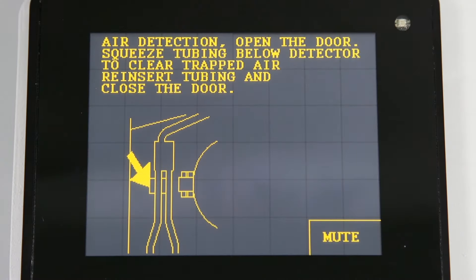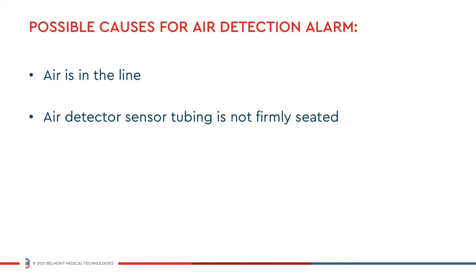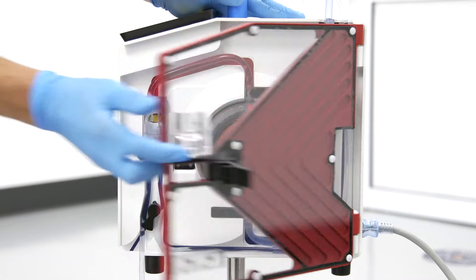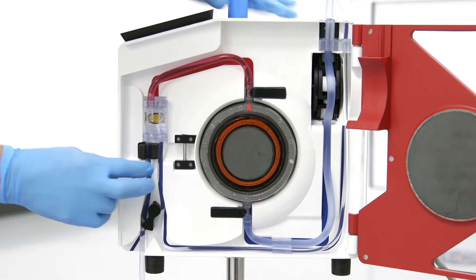The air detection alarm would be triggered if air is in the line, the secondary air detection sensor is not firmly seated, or if the air detector sensor is dirty. First, open the door to silence the alarm. Squeeze the tubing directly below the air detector to clear any trapped air out of the sensor.